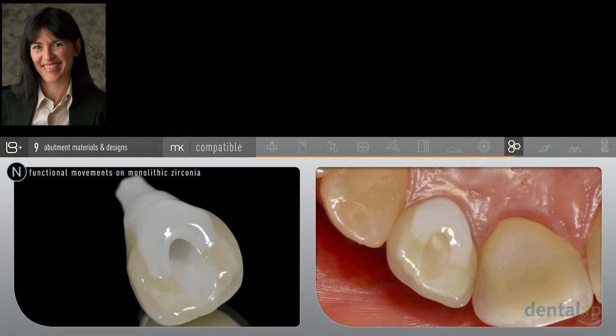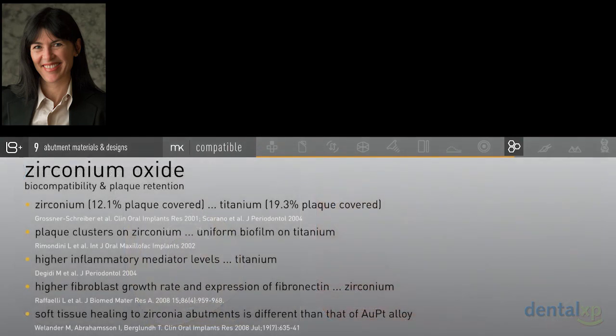Today, you're in the zirconia era. Obviously, there's also Emax and other materials, but you have materials that are strong, that are very resistant to fracture. You have materials where you can bring them into functional areas and reduce the risk of ceramic fracturing or chipping problems. I think about the benefits of zirconia from the biocompatibility perspective. This is a great material. It's even more biocompatible as we know it than titanium. Bacteria just doesn't like it as much as it likes titanium. It's a great material to have coming through that transmucosal area.